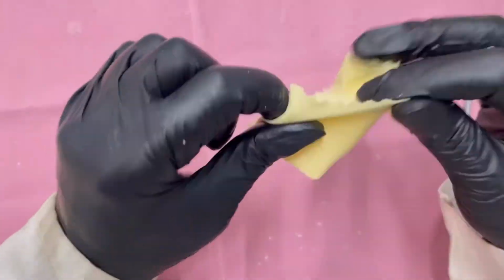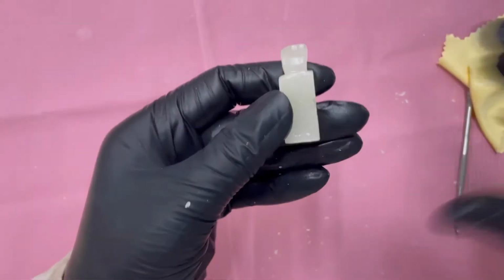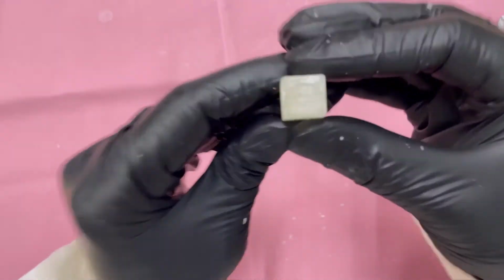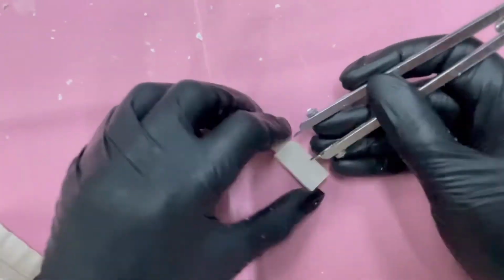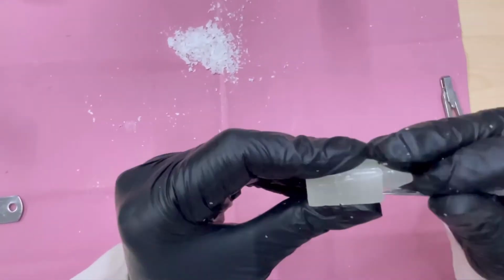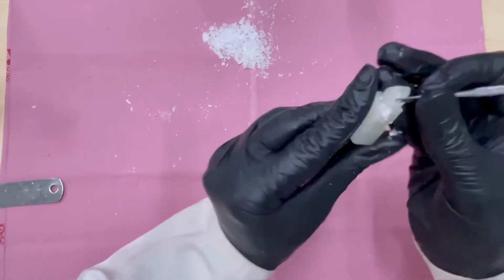With this, let's polish the crown. Here our crown is complete. For the root, mark 13 mm on all the surfaces. Now make an outline on all the aspects and start reducing the wax.